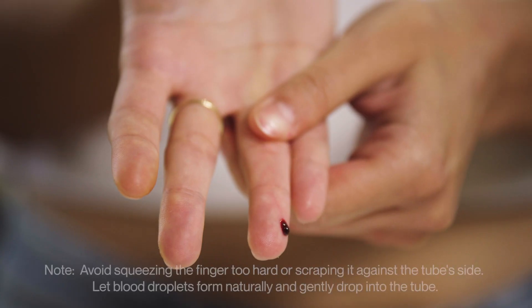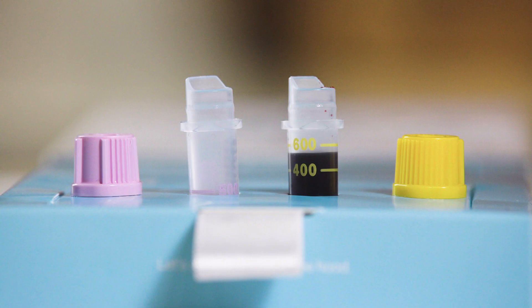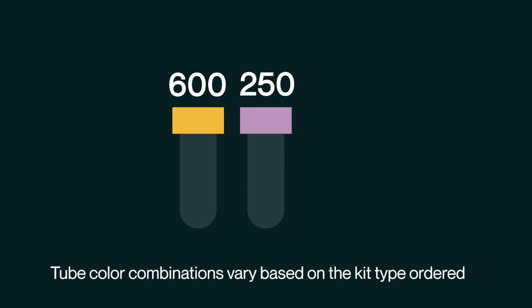Tap your blood into the tubes and massage your hand every 3 to 4 seconds in a milking motion, filling the yellow tube to the 600 mark, the purple tube to the 250 mark, and the orange tube to the 100 mark.